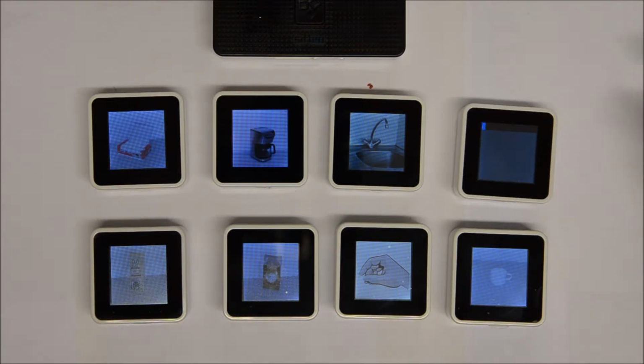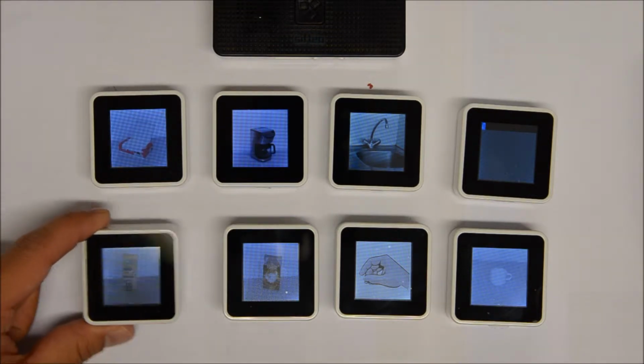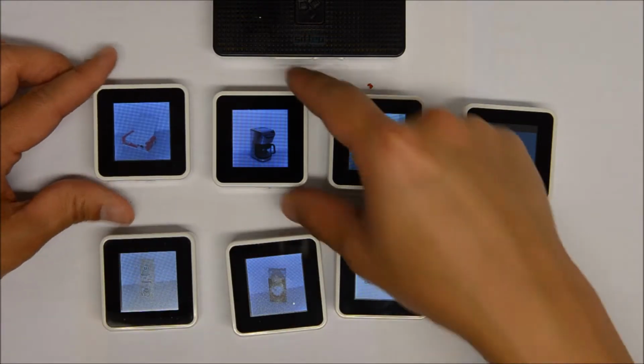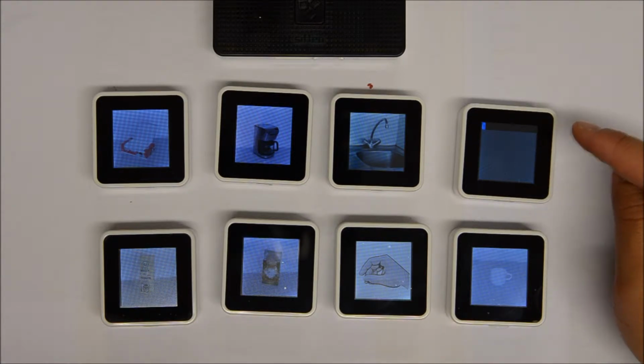Basically preparing coffee using a coffee machine and then with a sugar as well. The task has not been started, so this is an opportunity for us to show the patients each of the images on here, because considering it's quite small, they might have problems detecting the images. As you can see here, we have the coffee machine itself, a coffee filter, the coffee itself, the sugar, the tap. This is the hand. This is an actionable cube, and this is the cup, and this is an unused cube.